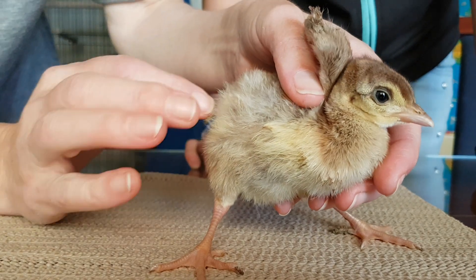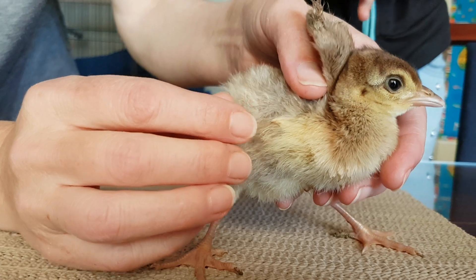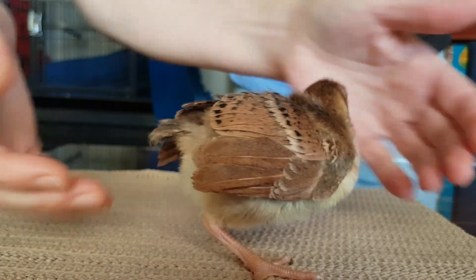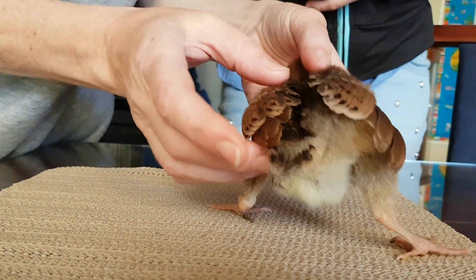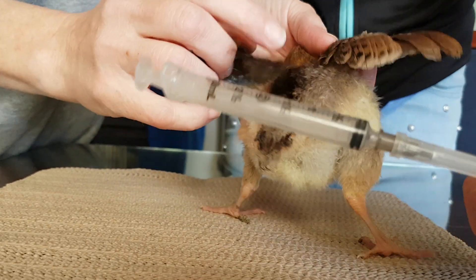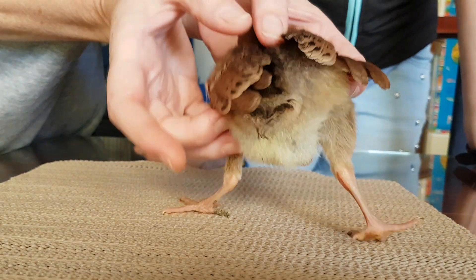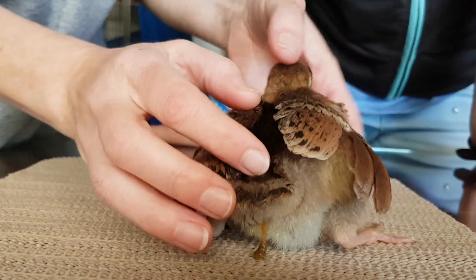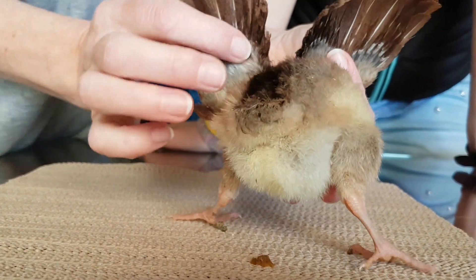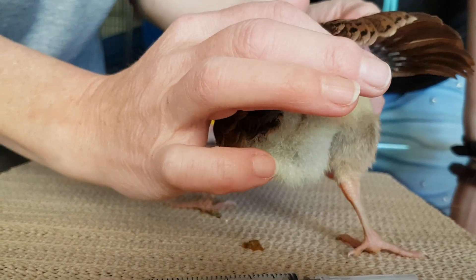We've been looking after this peafowl chick and she's got a blown air sac on her right side, around her abdomen area. What we have to do is basically put a needle into it and release the air so she doesn't blow up. Her spine is here — down the black stripe is her spine. You can see how big she is on her right side. This is all air. It's puffy like a balloon.